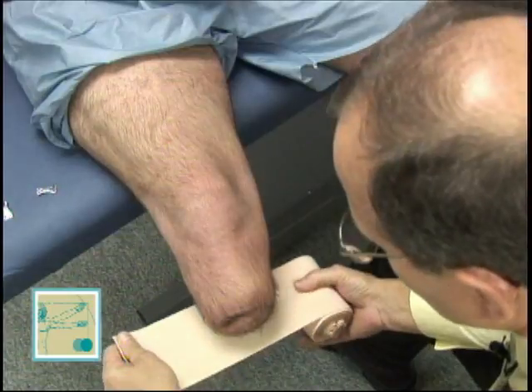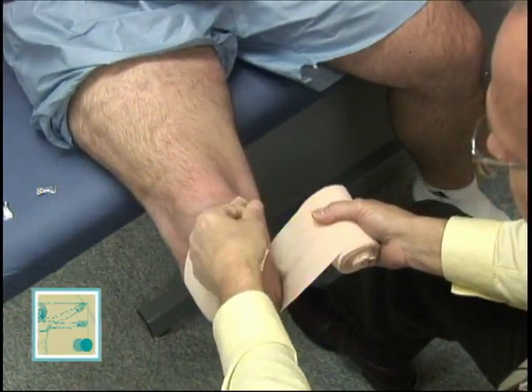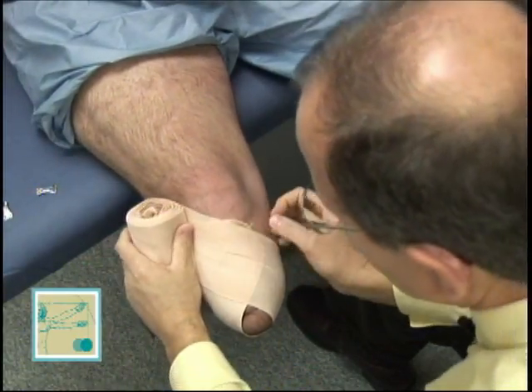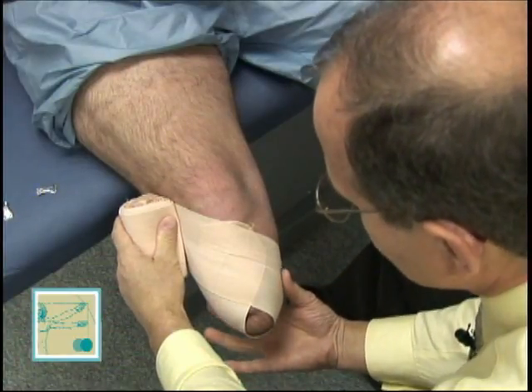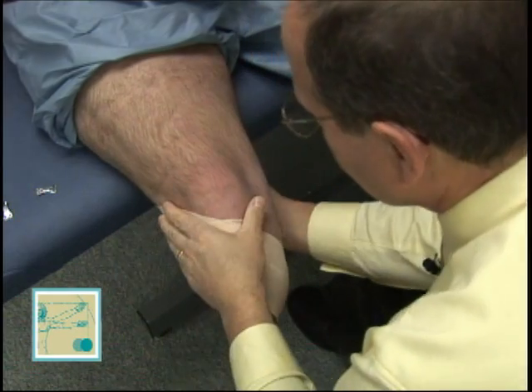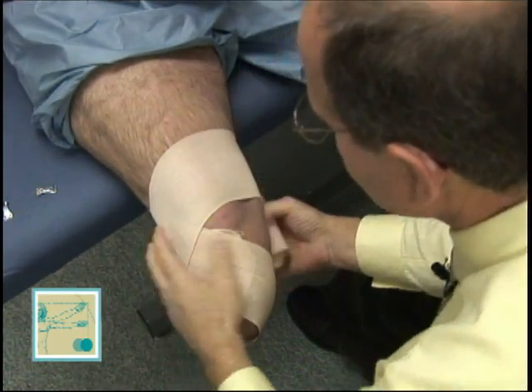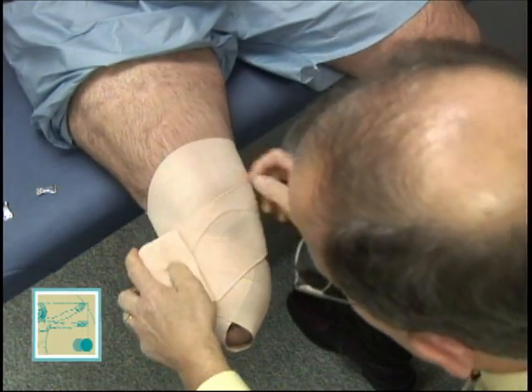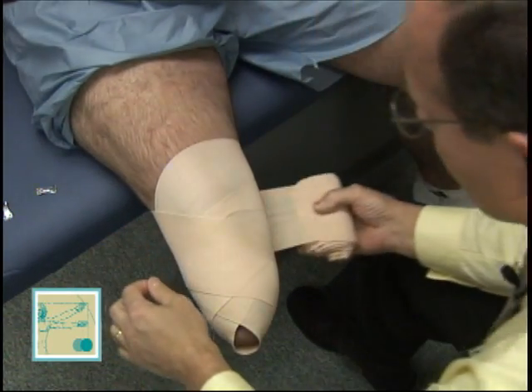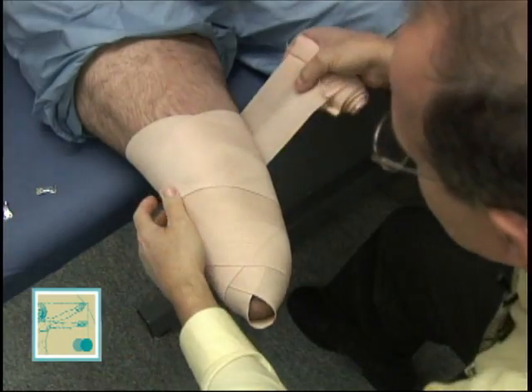To start the wrap, you want to take the wrap and pull the tissue anteriorly like this, cross it, and now you've got where the most swelling is — posterior lateral and posterior medial — covered. Then I'm going to bring the wrap up. The higher I go, the less compression I offer. I come down. Everything's captured. I will eventually come down and get that little dog ear down there.